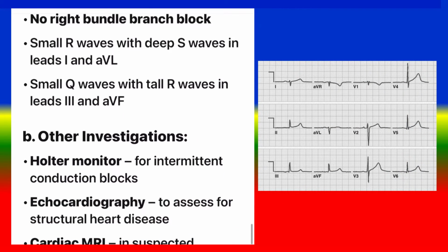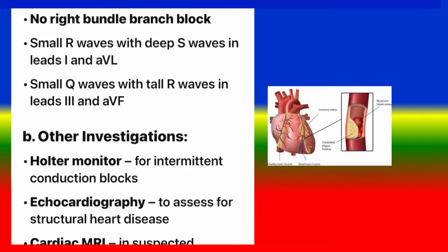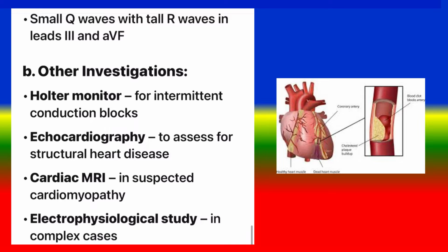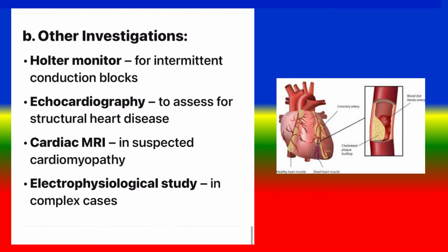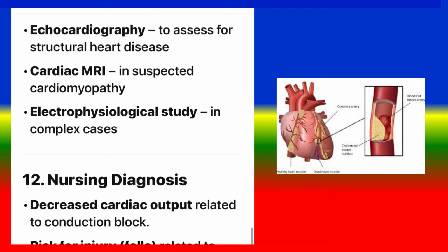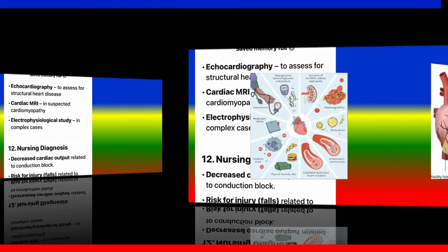small R waves with deep S waves in leads I and aVL, small Q waves with tall R waves in leads III and aVF. Other investigations: Holter monitor for intermittent conduction blocks, echocardiography to assess for structural heart disease, cardiac MRI in suspected cardiomyopathy, electrophysiological study in complex cases.